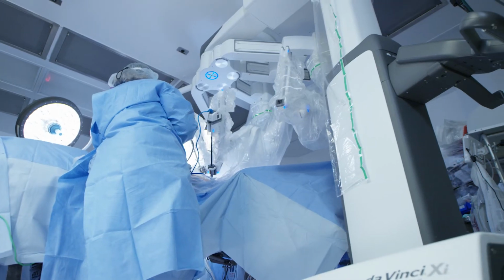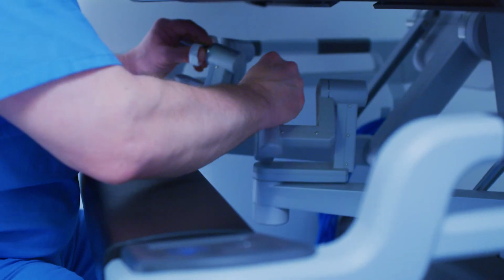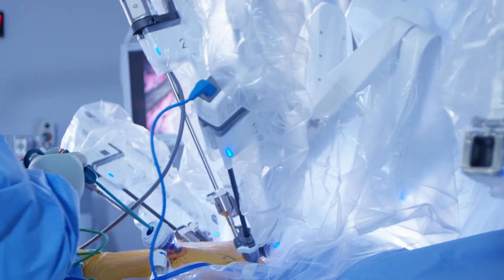But the classic way of doing the surgery is where, of course, with you asleep, we make an incision. We have to divide your breastbone in the middle. So we make an incision from here to here. It's a large procedure. A lot of times we can go in with the robot and we get excellent visualization, and we can remove this through the ports without making the large incision.